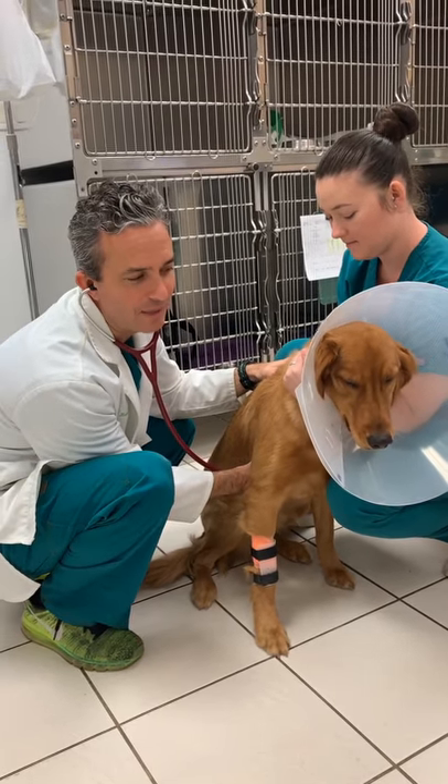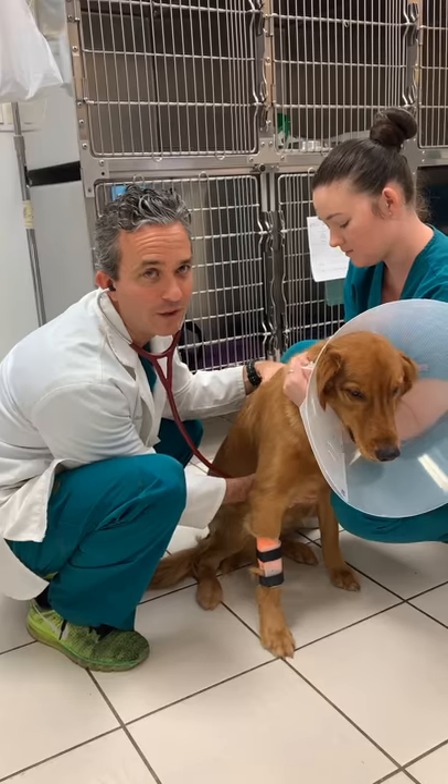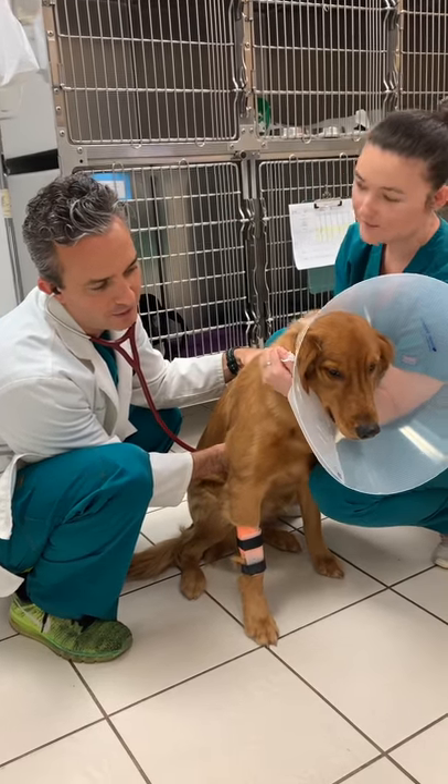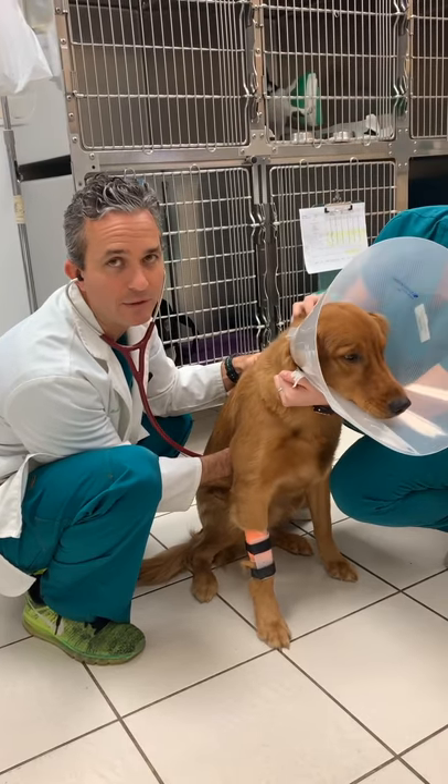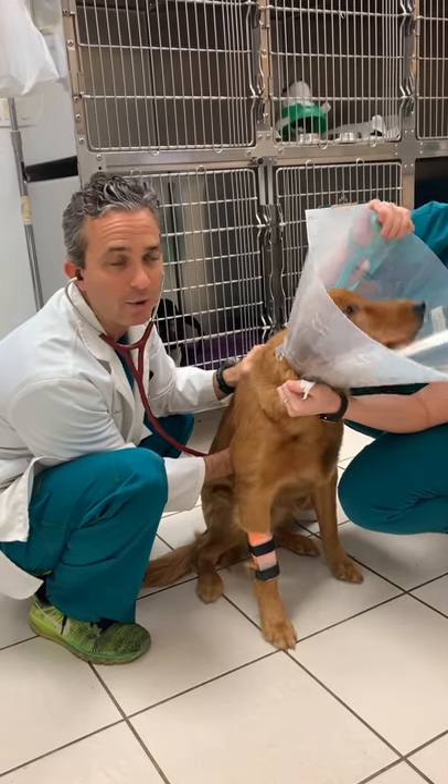We're here with Ollie. He's eight months old and he's getting neutered today, and we're just routinely checking his heart as part of his pre-anesthetic exam. And everything sounds nice and normal, with nice, strong, and normal heartbeats.